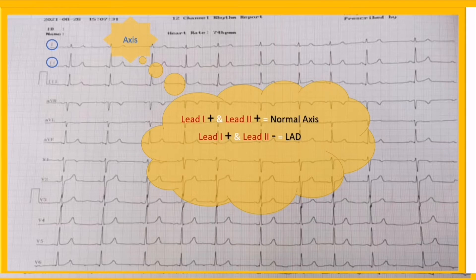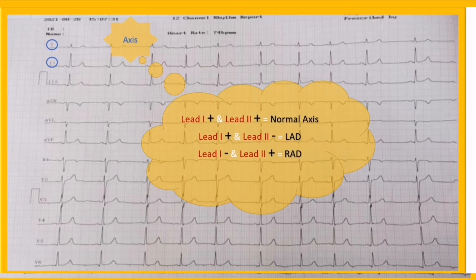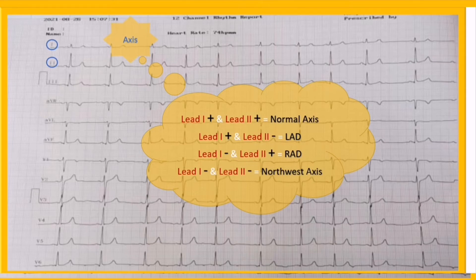If the axis is between 90 and 180 degrees, right axis deviation is present, and happens only if leads I and II are negative and positive respectively. An axis between minus 90 and minus 180 degrees is termed northwest axis or extreme axis deviation and occurs when both leads I and II are negative. In this strip, leads I and II are positive, so the axis is considered normal.